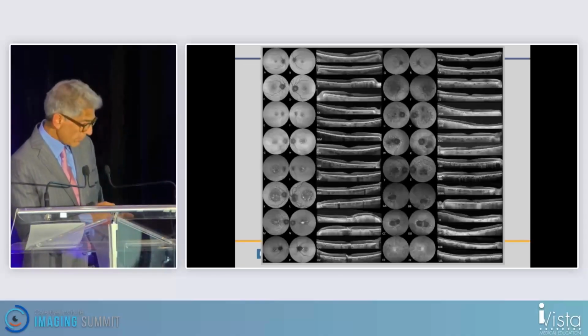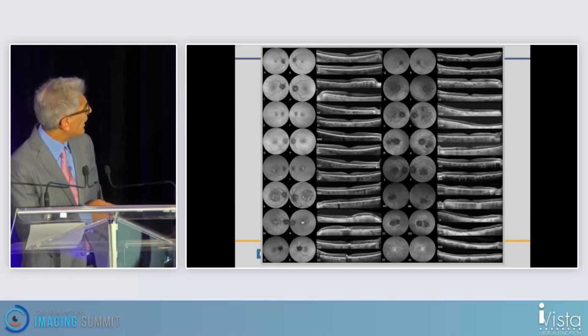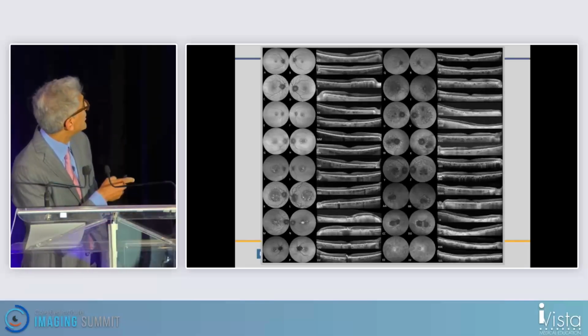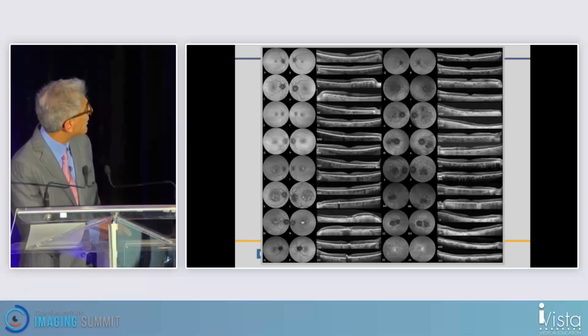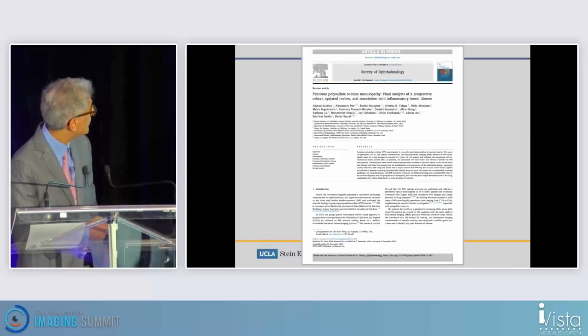And here was the original series of patients that we had with toxicity. I believe this was the first 16 patients, it looks like, out of the 100 that we screened. And you can see this progression in the severity of toxicity that goes all the way from this stippled, speckled pattern to these areas of atrophy and even significant central GA in the patients on the highest dosages.